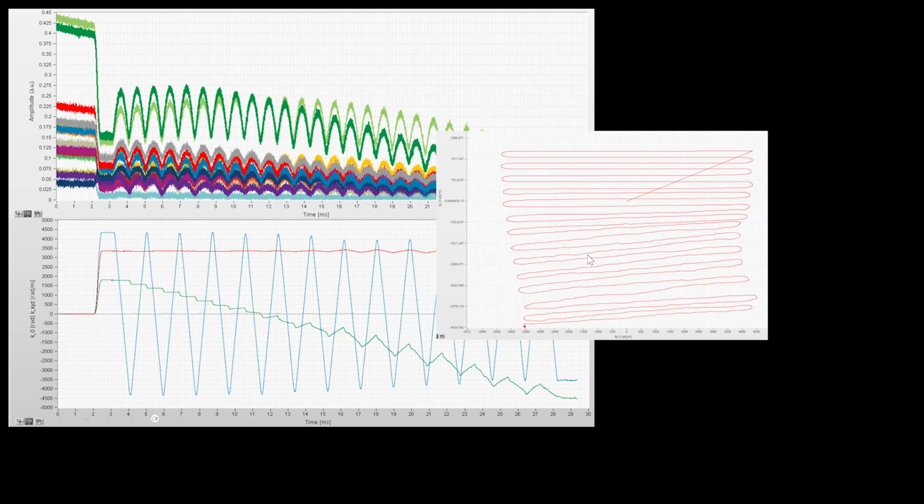And so we were really puzzled by this. And these were actually very time-consuming and taxing experiments. So we had basically done the whole ex vivo whole brain acquisition for 36, 40 hours or so. And then we put the field camera in and we were getting these types of measurements.